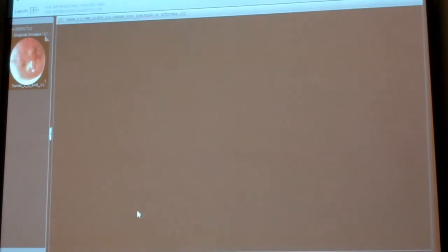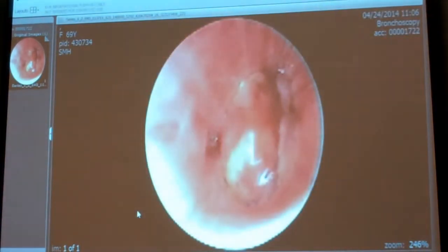And we could have put a lot more information on here to make it more interesting, but we put up enough to be dangerous. And then what we can show is the other side of this: if we click on one of these, it'll actually launch into our viewer, and it'll start pulling the images down through the WADO-RS directly.